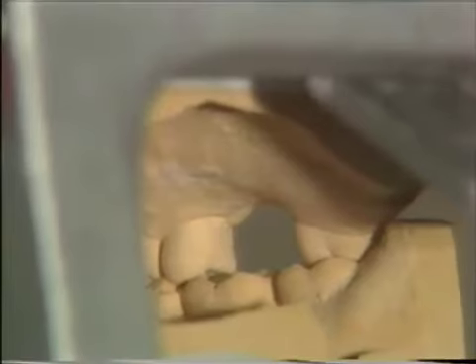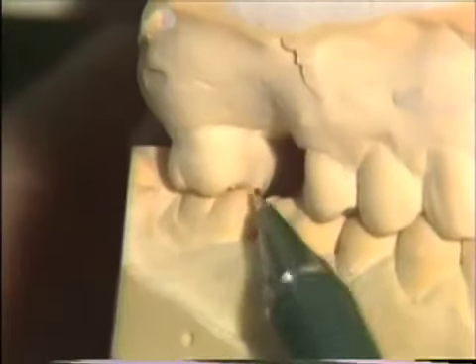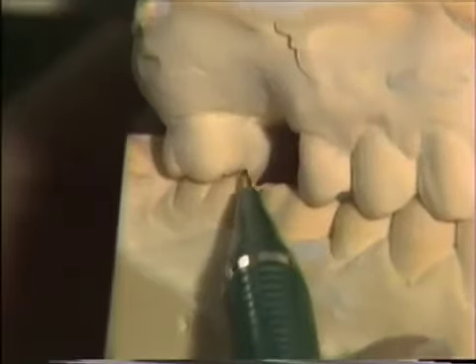We're going to place a rest on the distal marginal ridge. You'll notice that there is space on the distal marginal ridge, so very little preparation has to be done on the marginal ridge of the maxillary bicuspid. However, the maxillary molar has very tight interdigitation. I'm going to turn this model around so you can see that from the mesial buccal. You'll notice that the way the lingual cusp and the mesial marginal ridge are on the model — when you look at it from the mesial buccal — it's quite tight there, so we're going to have to do a little bit of relief to make the rest on that marginal ridge.